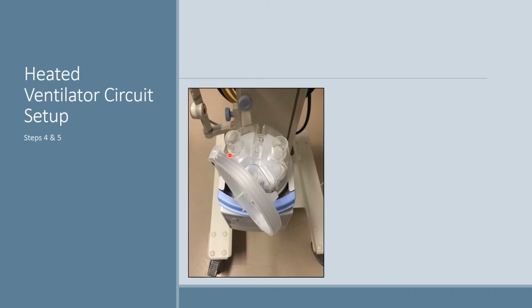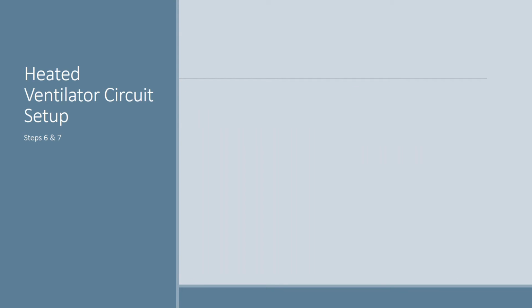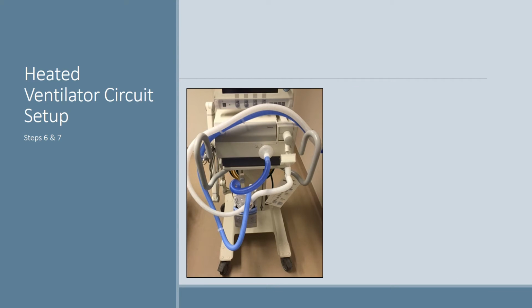And then, as I stated earlier about the sterile water, this is where the tubing uncoils and spikes right into that sterile water bag. Next, I'll place that blue tubing and extend it from one side of the humidifier and connect it to my inspiratory limb. This fits right onto that bacterial filter on the inspiratory side. Next, I will take my circuit and connect it. This white limb will connect right onto your expiratory filter. And then I'll take my heated wire side and connect it to my humidifier.